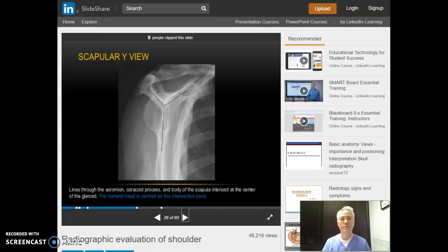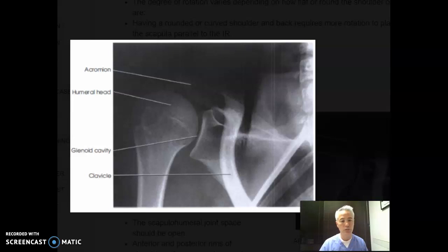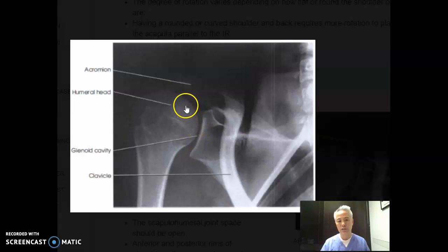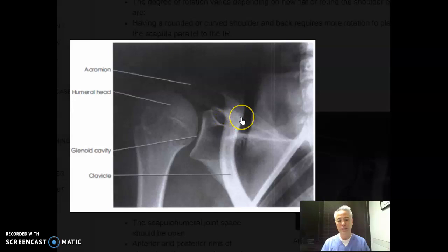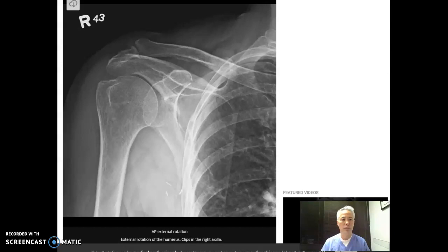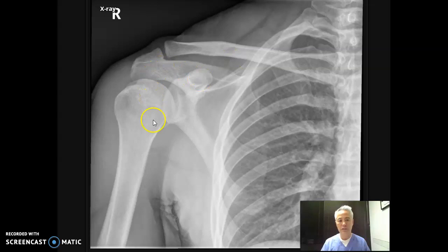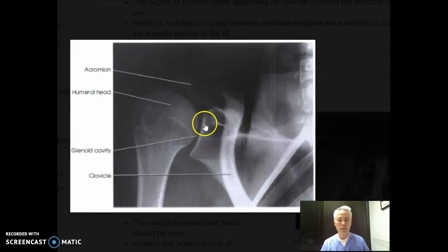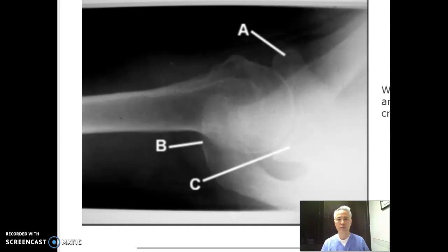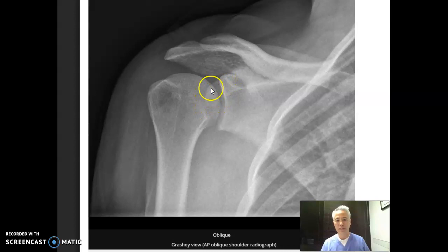The Grashey view is basically a true AP of the glenoid cavity. On this one, you should see the glenoid without any superposition of the humeral head, so we're really looking at that joint space. We do need to see part of the humerus and a little bit of this area, but it shouldn't be open as much as our AP view because we don't need the entire scapula on there — we just need to focus on the glenoid space. What we're doing is turning the body so that we can get that space as open as possible. The coracoid will go over this space just a little bit, which is perfectly acceptable, but we should open up this space the best we can.